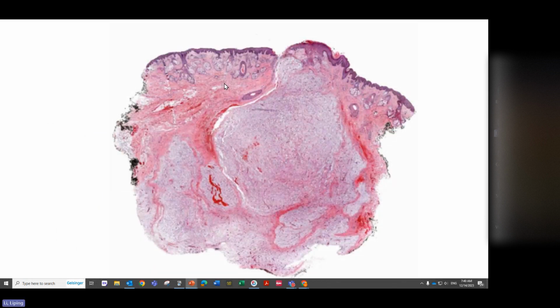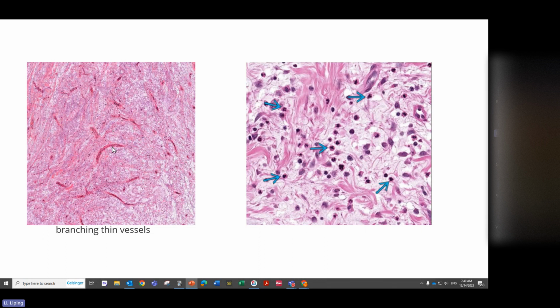As I mentioned, low power, you will know this is not deep angiomyxoma because kind of superficial, it always touch the epidermis. And then we have this vaguely lobular structure, and then separated by this highlights fibrotic septae, and then really hypocellular. Then we can see the small vessel, not hyaline thick wall vessel, this thin wall vessel, and then kind of small. Then we will see neutrophil.